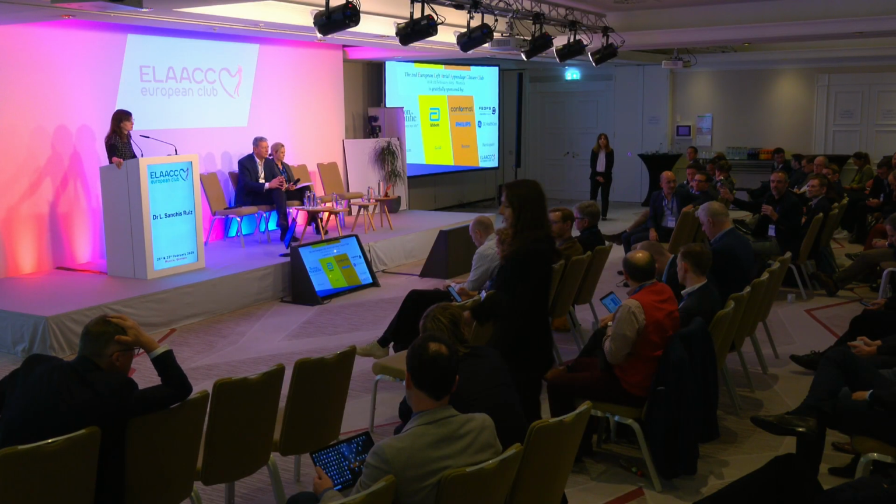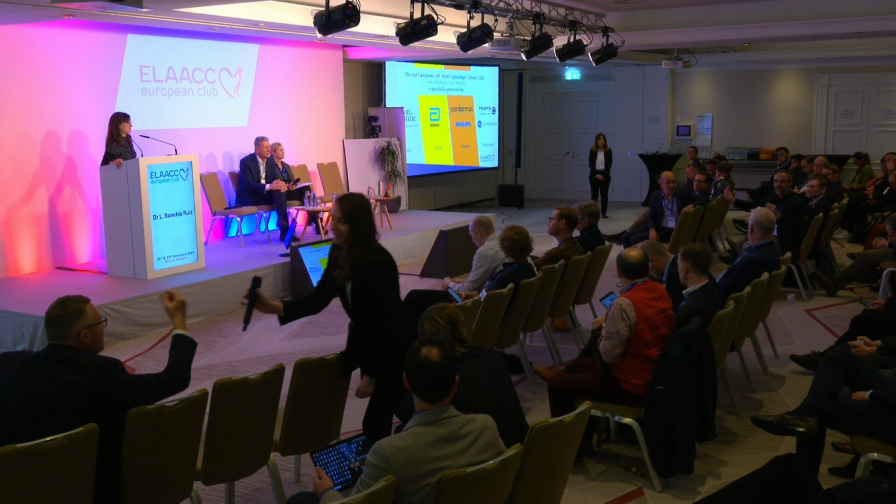Marek, just one comment on that. Not only for measuring, but also for anticipating the risk of air embolization. If you have such a low pressure, you can even have negative pressures. So you have to be very careful about sucking air, and flushing with wet. I think we always do it, it takes less than 20 seconds. And it's worth it because you detect those patients that suck the blood, and we have had some cases. It's really worth it, not only for measuring, but also to prevent air embolization.